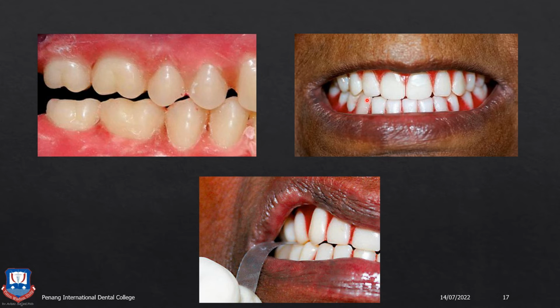So this needs to be corrected by taking a new intraocclusal record between the upper and lower teeth. In this case, when there's an open bite, you can put softened wax here between the teeth, and you take a record of that side, and then you re-articulate the upper and lower teeth setting with the models. But for this, you have to make sure that the record bases are stable. Otherwise, you will again keep getting errors.